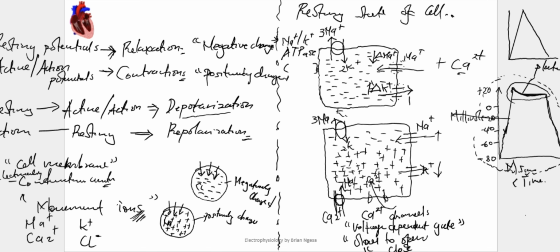This becomes the depolarization, because you are moving up, and this is the movement where we are moving down. So this is the repolarization.